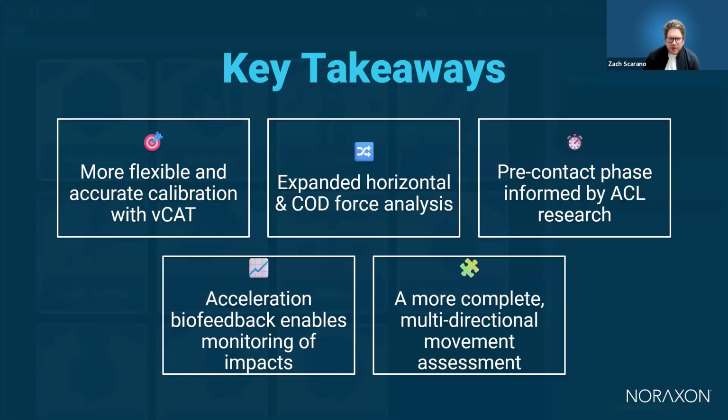Third, we have the pre-contact phase, which brings MR4 in line with the leading ACL research. Again, I would encourage you to look at these publications from Benka and Zebis. These would give you more visibility into that neuromuscular preparation just before contact. And so, of course, this is particularly useful in assessing landing readiness, movement strategy, and injury risk.